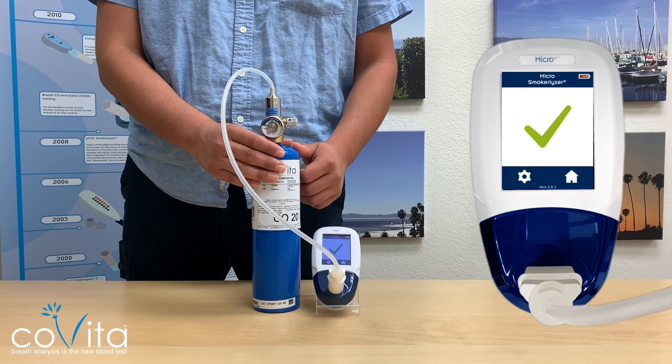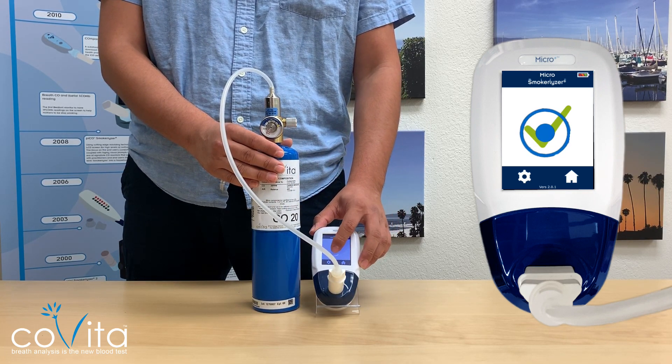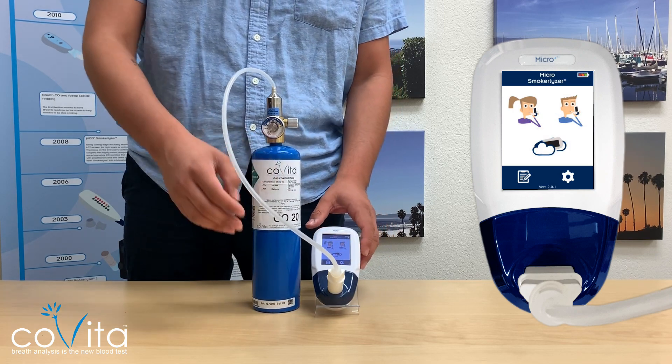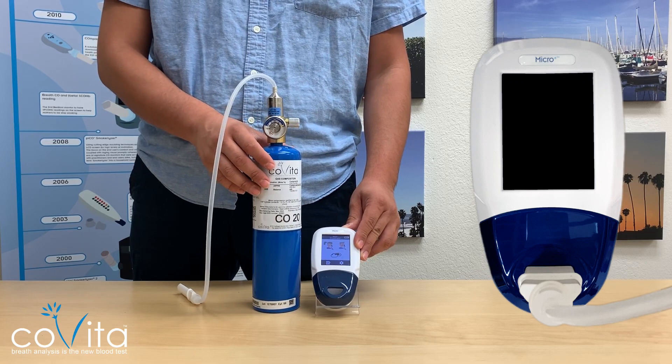Now that calibration is complete, ensure you turn off the calibration regulator and press the green check mark to lock in calibration. Congratulations, you have successfully calibrated your Smokerlyzer monitor.